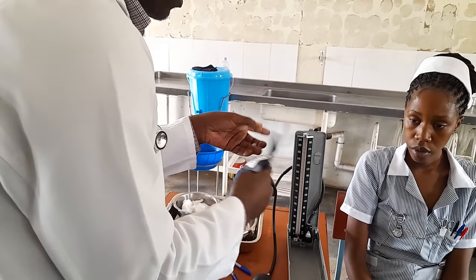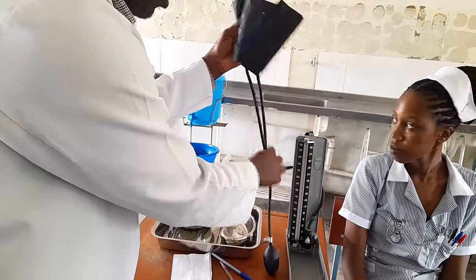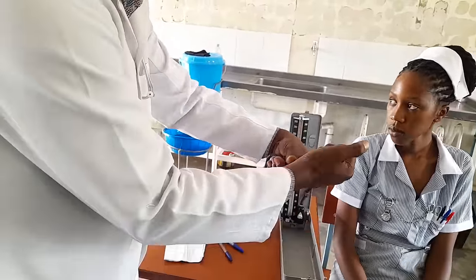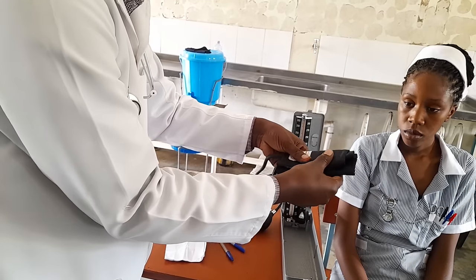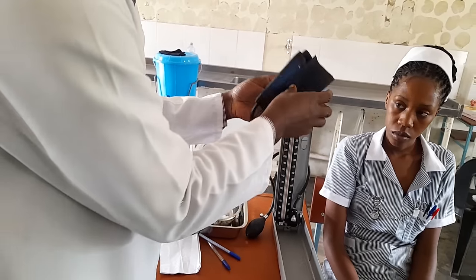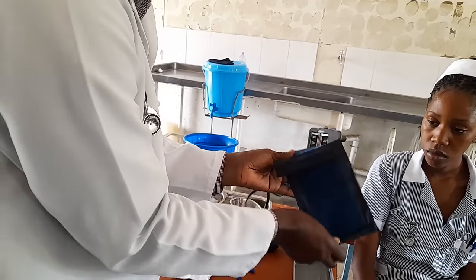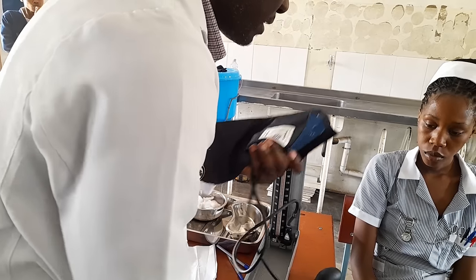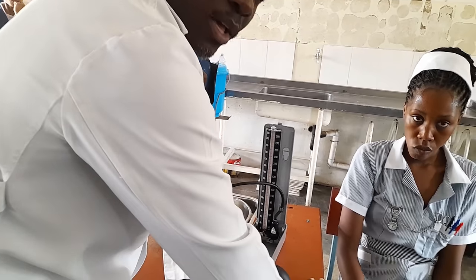Another issue is on the cuff. You're supposed to press or squeeze it to remove air that was already in it. When you get the cuff, go to the client and ask them to rest their arm.